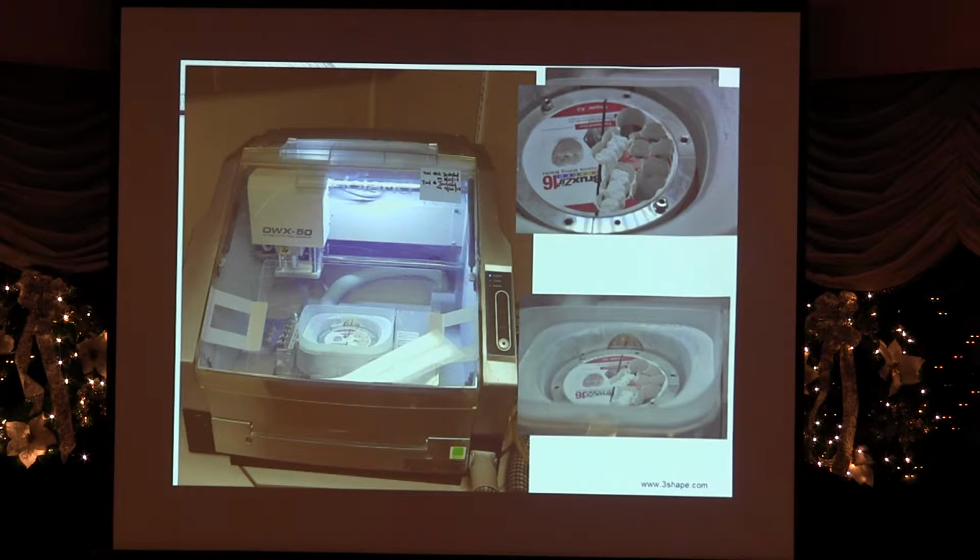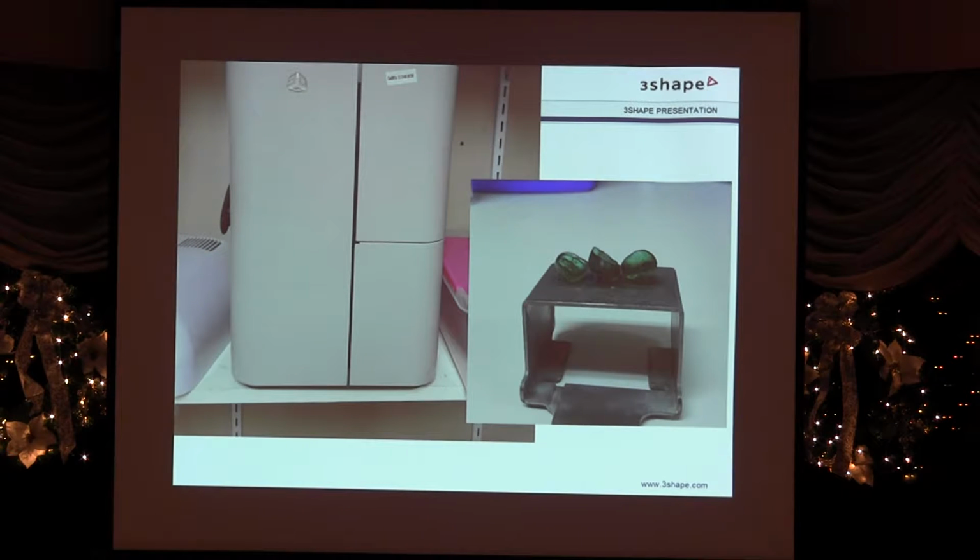And then these are our 3D wax printers. With any design output, we can print our wax coping. You can see here. If we don't want to mill in zirconia, we can either mill the wax, or print the wax and cast it, or if it is Emax, we can press the Emax. So in the end, from CAD designing to CAM printing, we then go back to the same lost wax process and either cast our copings or press our Emax crowns.